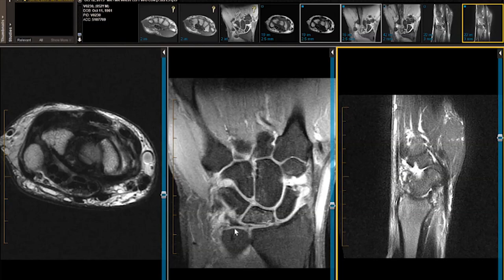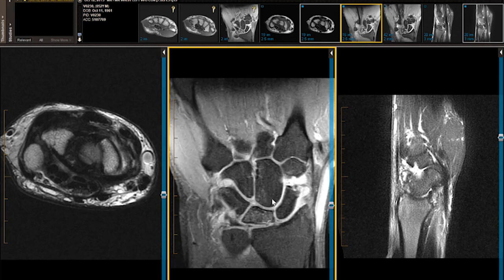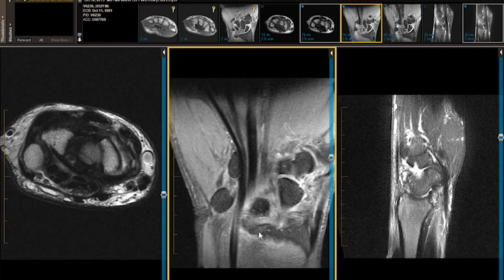This is a 52-year-old man who complains of medial wrist pain and a burning sensation while shoveling and doing yard work one month ago. They were concerned about a triangular fibrocartilage tear, which he has.